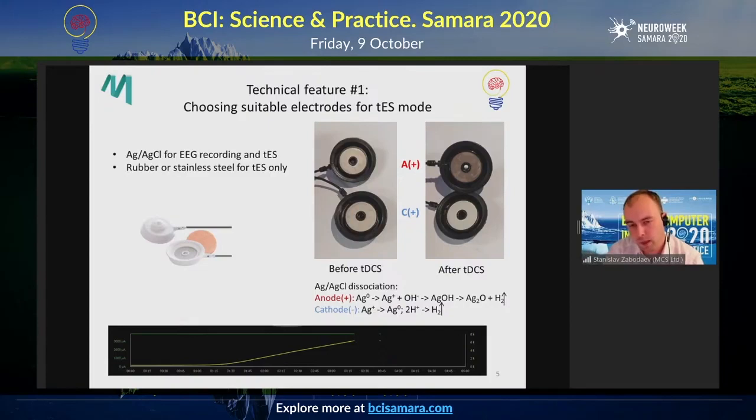The rest, when it comes to the lifetime of an electrode, comes down to the type of current used, the surface area of the electrode, and whether it is coated with the silver chloride paint, or whether the paint is integrated into it.